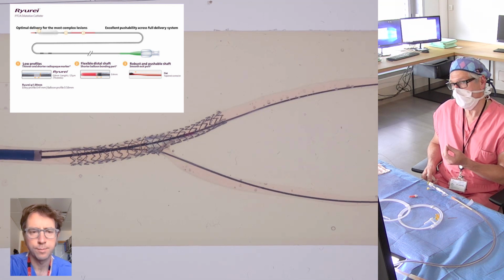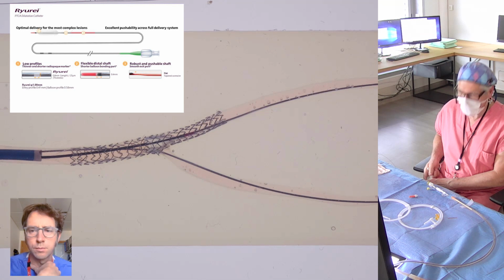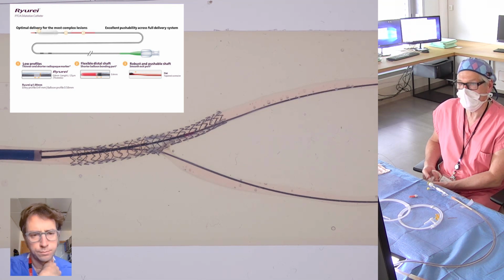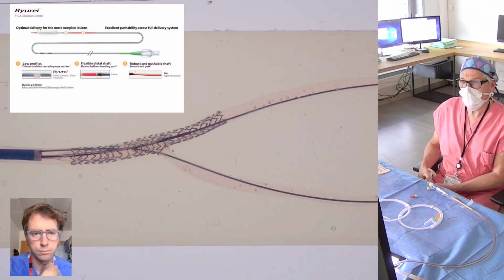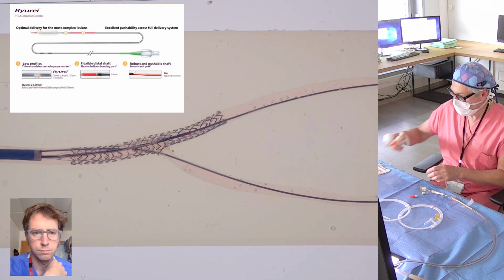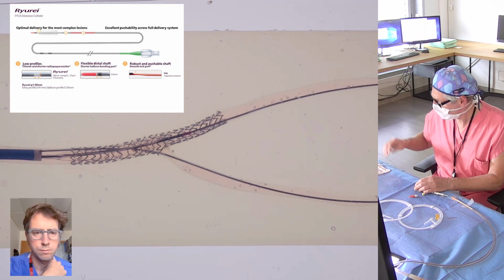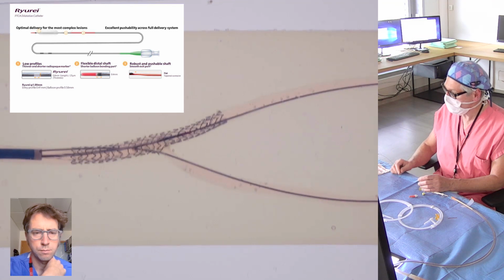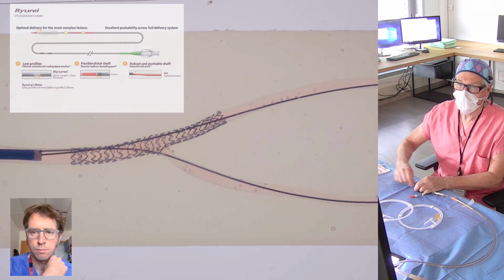And you can also adjust the size according to the pressure that you are using in order to be sure that the stent is really fully deployed. So it was a 3.0 15. So now we have corrected this deformation with the proximal POT up to the proximal part of the stent. And maybe we can do the final OFDI pullback.